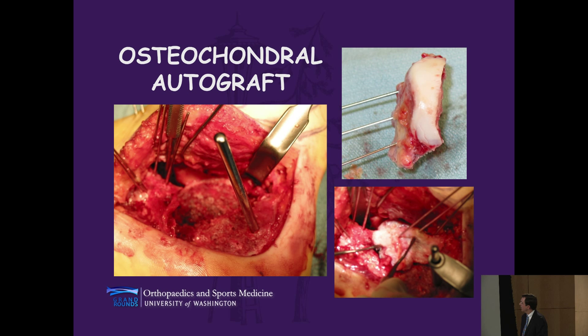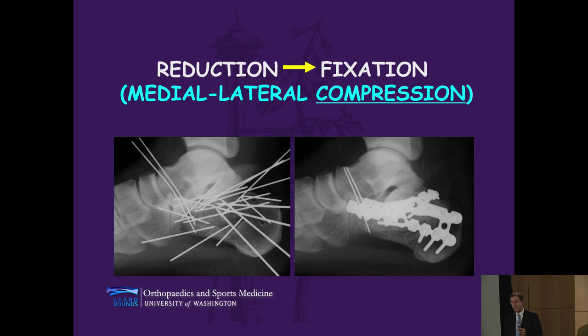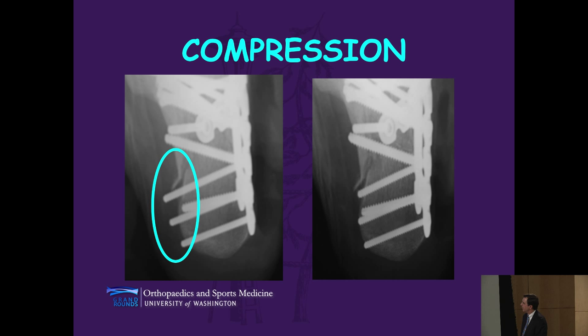By affixing the alignment of the foot and reducing the joint surfaces, you then have to provide medial to lateral compression, and that's afforded by the plate. When you actually compress this fracture, as Tom Rudy did with pilon fractures, we compress enough to restore the width of the heel, so that screws that you initially think are appropriately of the right length are actually too long and have to be shortened.